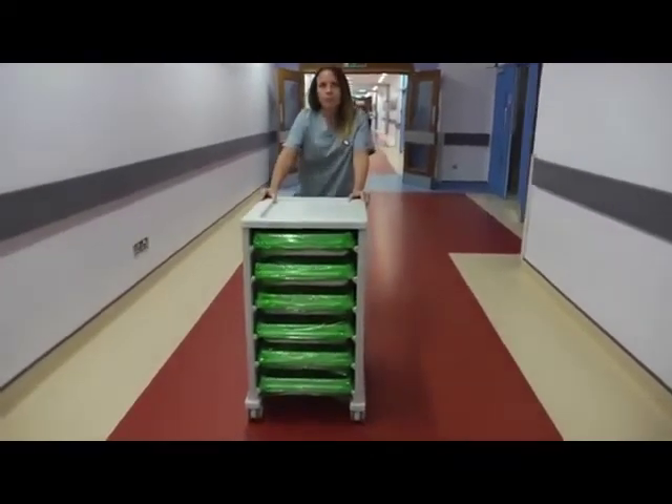Clear identification reduces the risk of equipment cross-contamination and assists in improving the efficiency of the endoscope reprocessing cycle. The reusable trays guard against costly equipment repairs by protecting the scope from damage during transport.